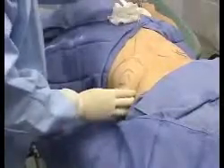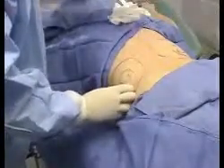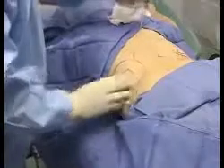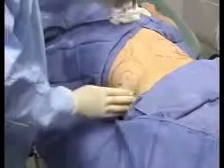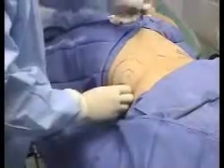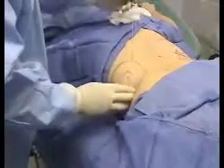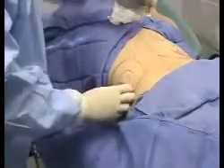So we're going to get to the end point much quicker than we did, obviously, when we had 12 watts or 18 watts or even 20 watts, and this will go all the way up, at least mine will, to 40 watts. We haven't gone that high yet. At some point we'll be able to figure out what's the right amount of heat energy to make this a little more fun for the patient and practitioner, so that it doesn't take so long and it's not so arduous. You can imagine at 6 watts, which was the original Cynosure device, and a 300 micron fiber, how long you'd be here. You're at 3566. Okay.